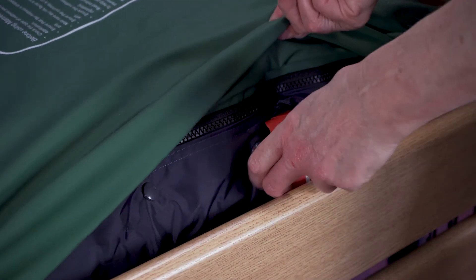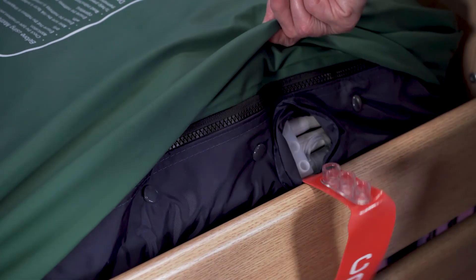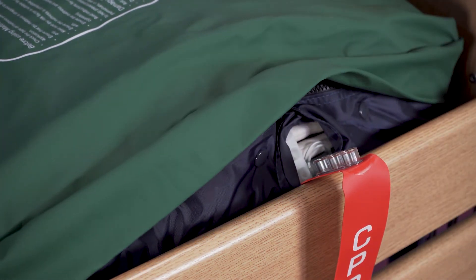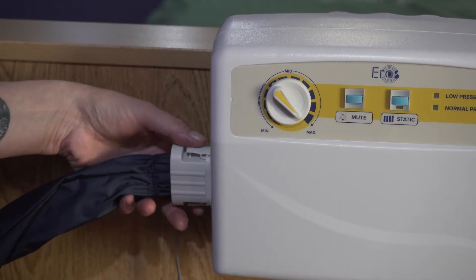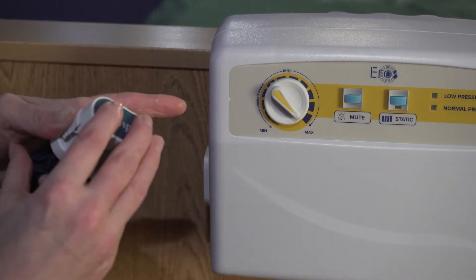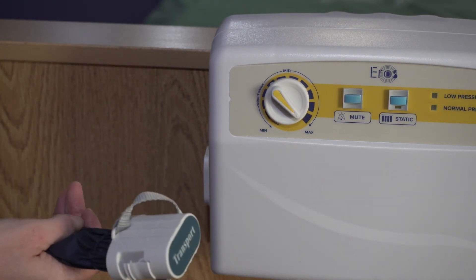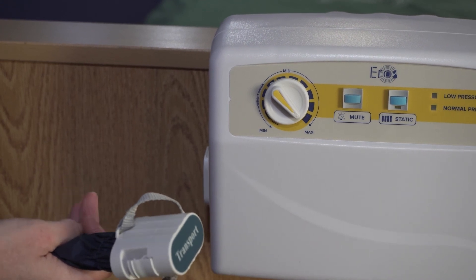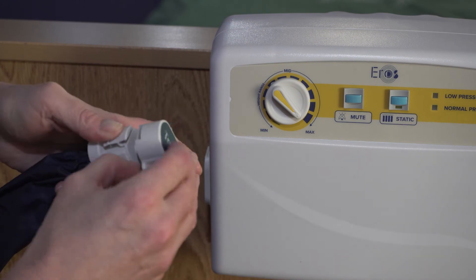For rapid deflation, simply pull the CPR tag firmly in a downward movement and the air will be released from the mattress. The umbilical cord connector includes a transport cap which means the mattress will remain inflated for up to eight hours, to ensure the support surface provides pressure redistribution in power outages or when transport is required.